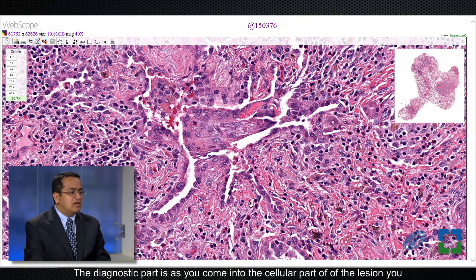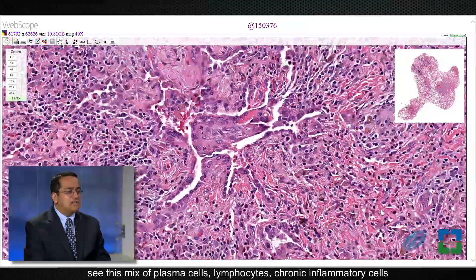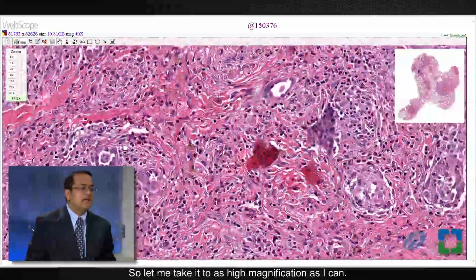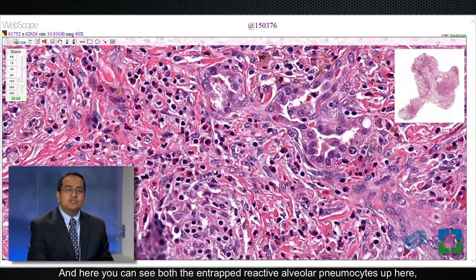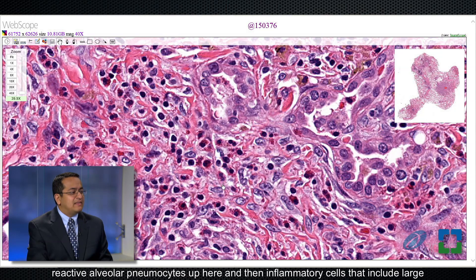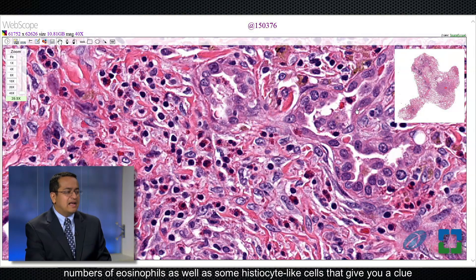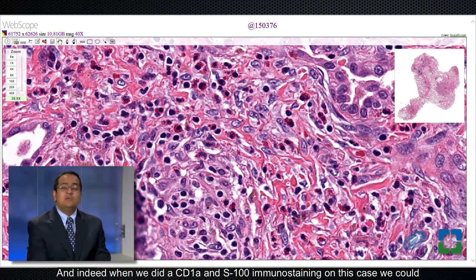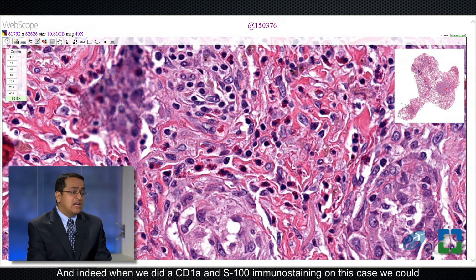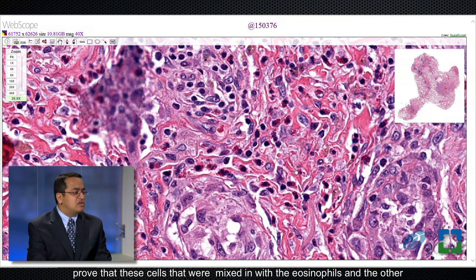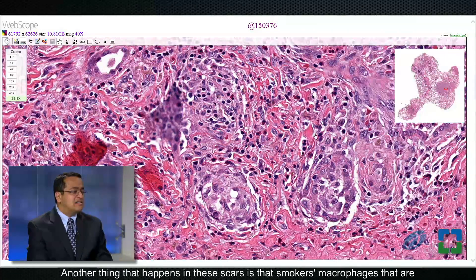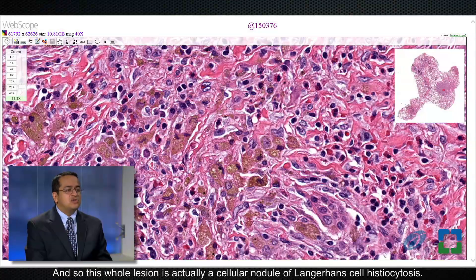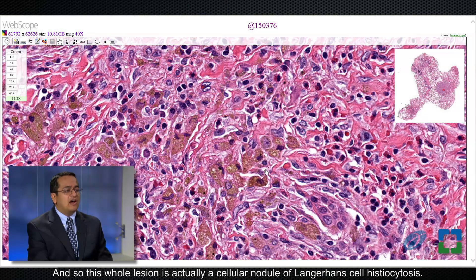The diagnostic part is as you come into the cellular part of the lesion, you see a mix of plasma cells, lymphocytes, and chronic inflammatory cells, but also lots of eosinophils. At high magnification you can see both the entrapped reactive alveolar pneumocytes and inflammatory cells that include large numbers of eosinophils as well as some histiocyte-like cells — giving you a clue that these might be Langerhans cells. Indeed, when we did CD1A and S100 immunostaining on this case, we could prove that these cells mixed in with the eosinophils were Langerhans cells. Additionally, smokers' macrophages accumulated within the scarred areas, making this whole lesion a cellular nodule of Langerhans cell histiocytosis.